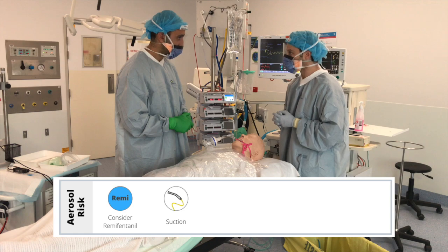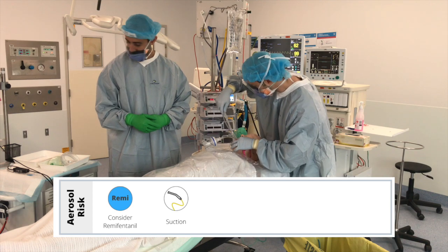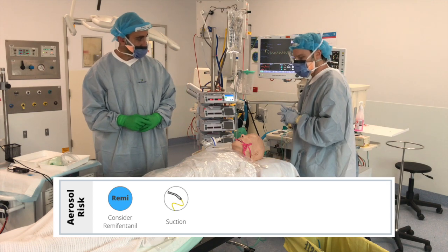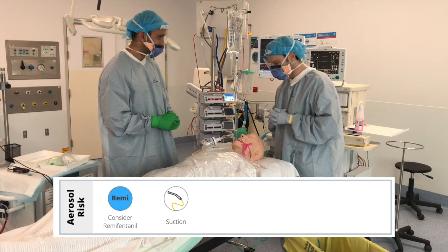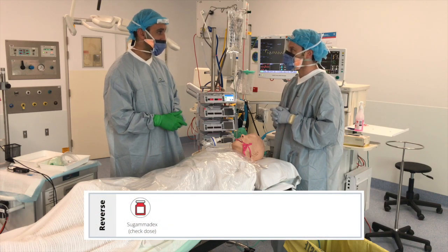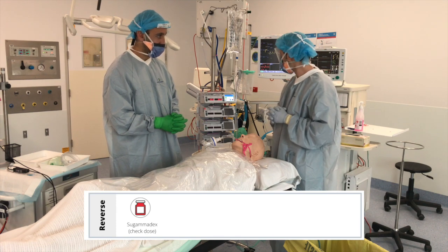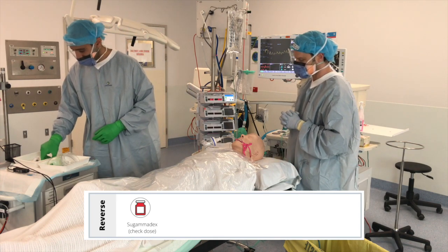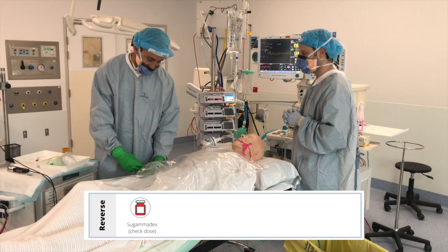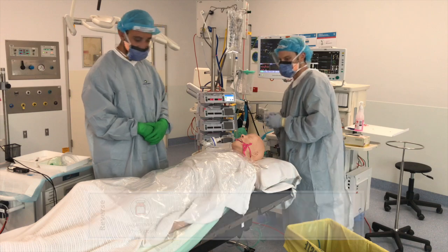We're going to suction the airway before we reverse. Sure. And we've given anti-emetics already. We have, yes. Currently we're running remifentanil, which is an appropriate level for extubation. Okay, I did a train of 4 just before. And a train of 4 was 2. Okay, so we should be able to use 200 milligrams of sugammadex for this particular patient. We're ready to administer that now. Yeah, we're confirming the remifentanil is on 3. Yep, 200 milligrams of sugammadex for me. I'll push that through for you. Okay.